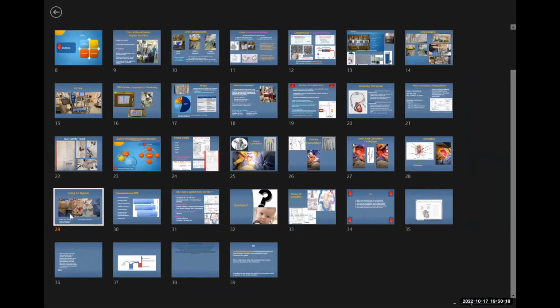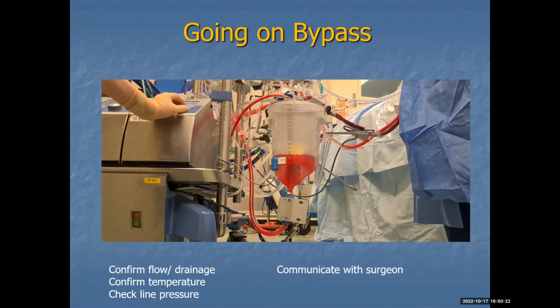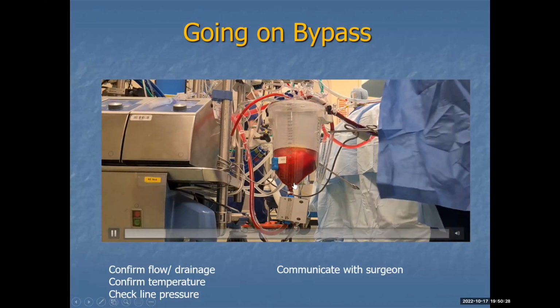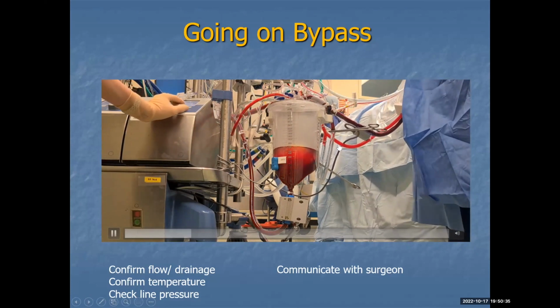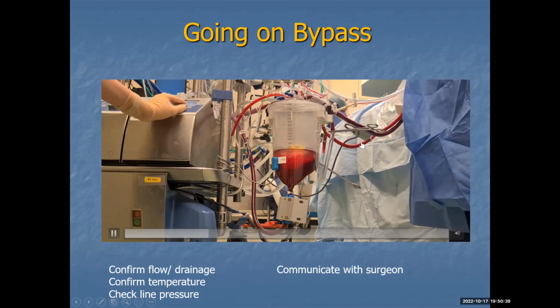So there we go. There you go, nice dark blood there, slowly filling into the reservoir. Nice and dark, and the important thing is the oxygenated blood going back.